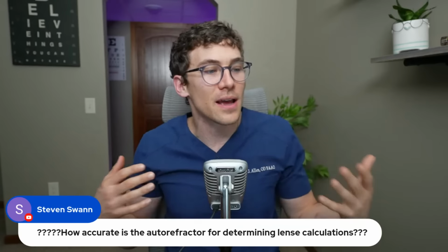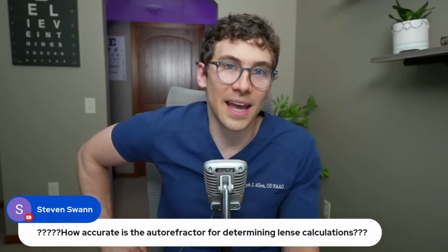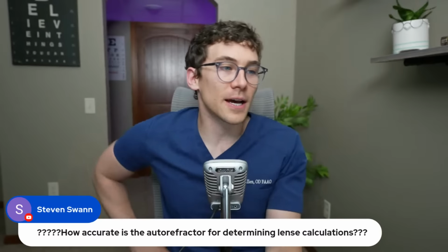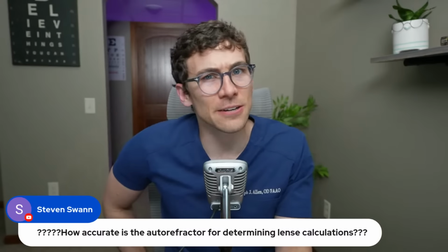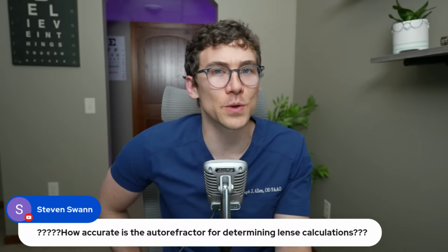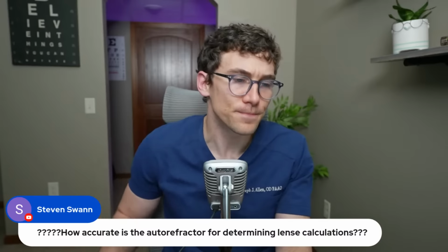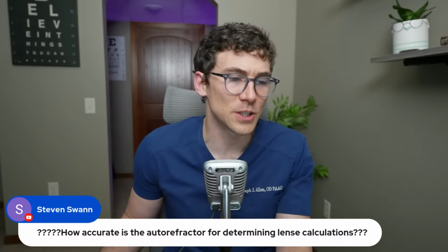But I would say autorefractors, they're a great tool, but unfortunately they can be fooled. And every brand's a little different. And if you ask every different eye doctor, they'll tell you maybe 2 or 3 different brands are more accurate than another. So good question.